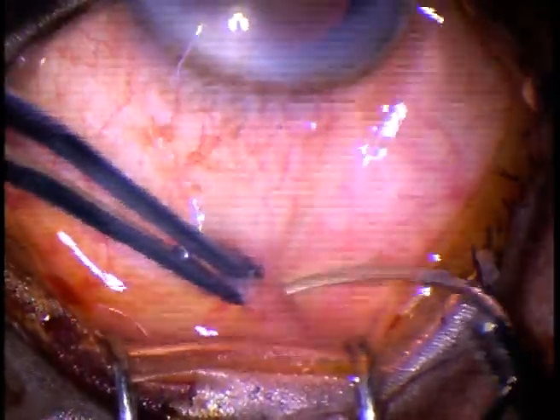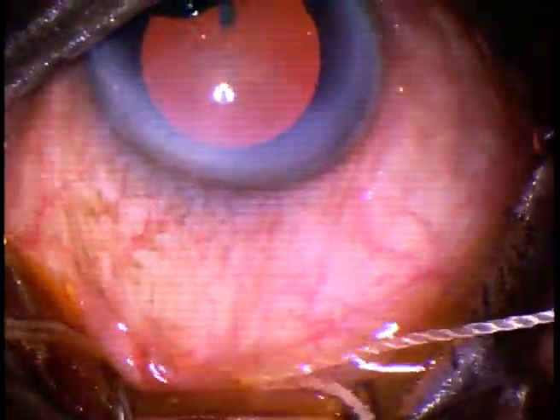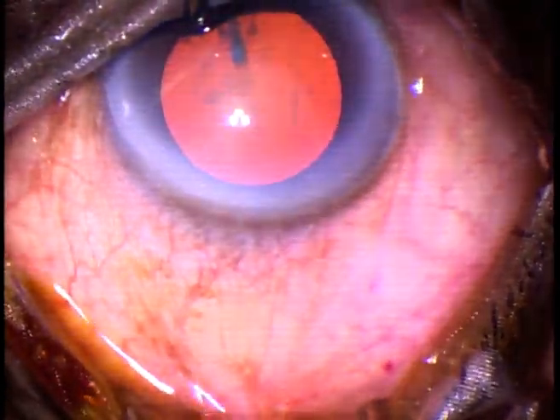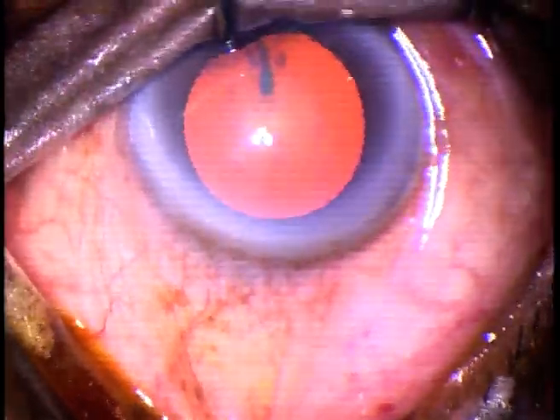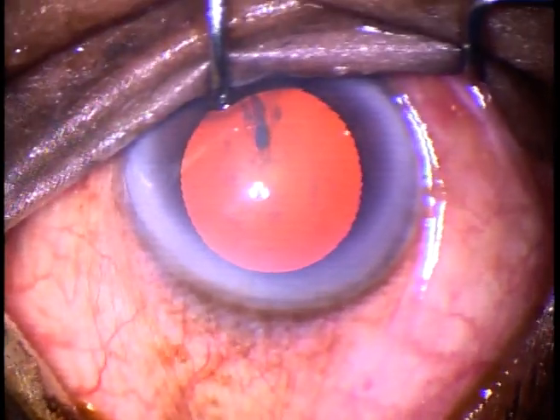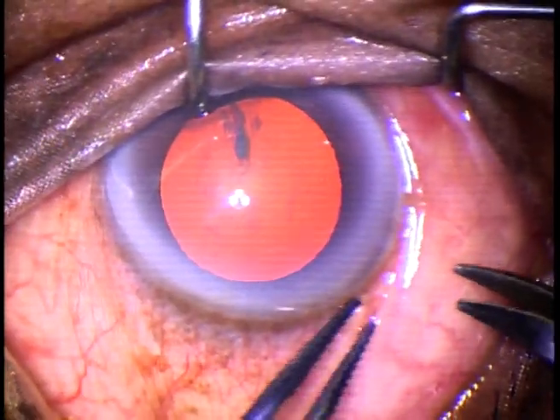This is the Superior Rectus Bridle Suture. This helps in keeping the eyeball stable. Conjunctival Peritomy becomes easier, and wet-field cautery becomes very much comfortable. It is good for beginners to use this Superior Rectus Bridle Suture.